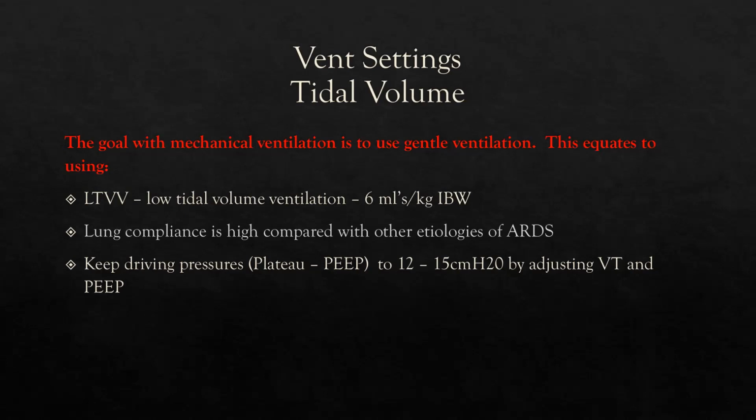How can you do that? You can do it by adjusting the patient's tidal volume. So let's say you have them in PRVC and their targeted tidal volume is, I don't know, 400 ml. You do an inspiratory hold and it shows 30 centimeters of water, and they're set at 5 of PEEP. What is their driving pressure?